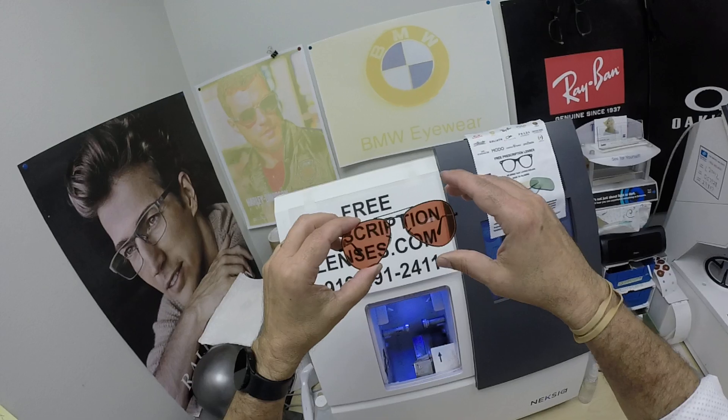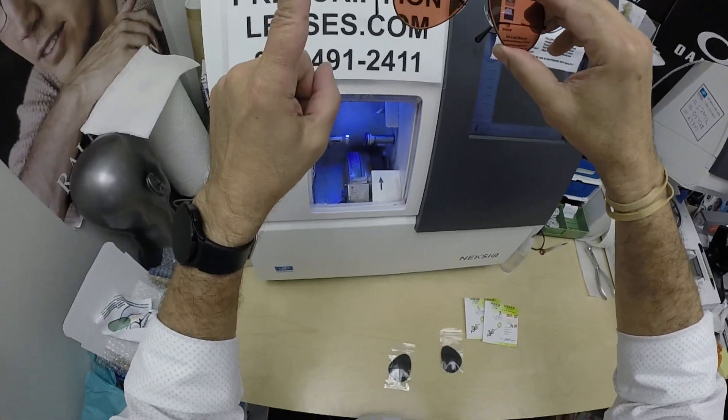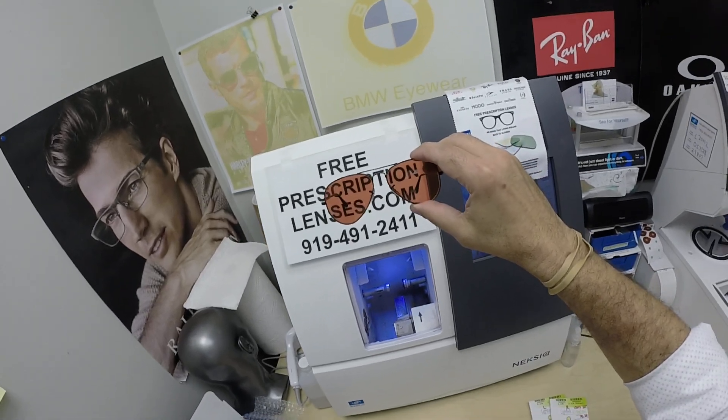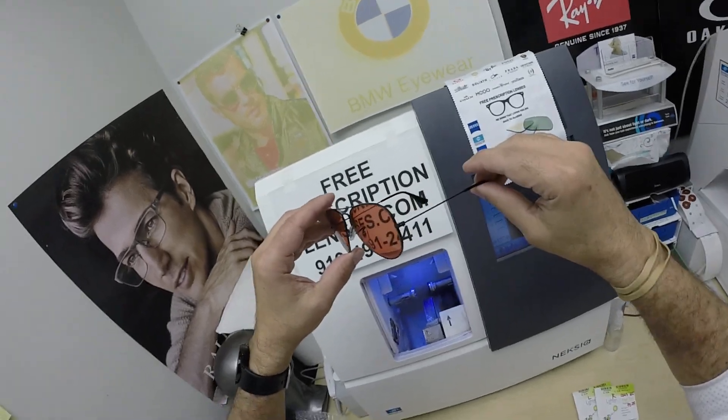I actually got one guy who just loves these for the way they look cosmetically, but they are designed to actually accomplish some good. Now I can do these in almost any frame that you send me — one caveat — there are a few frames out there I can't cut lenses for and I would have to send them to a specialty lab to have done, but for the most part, that's not a concern.